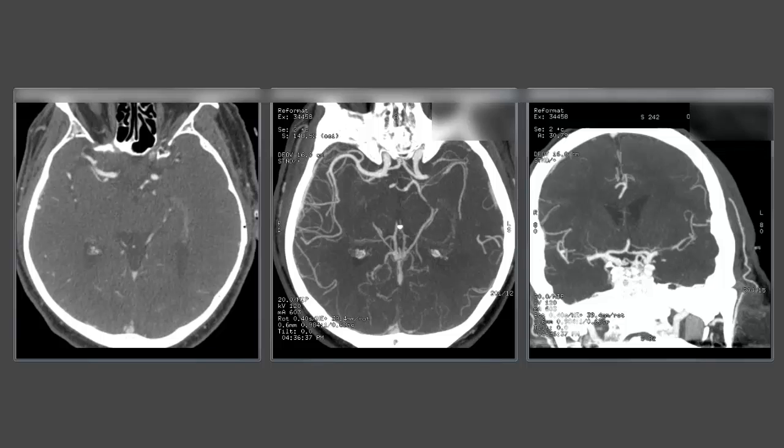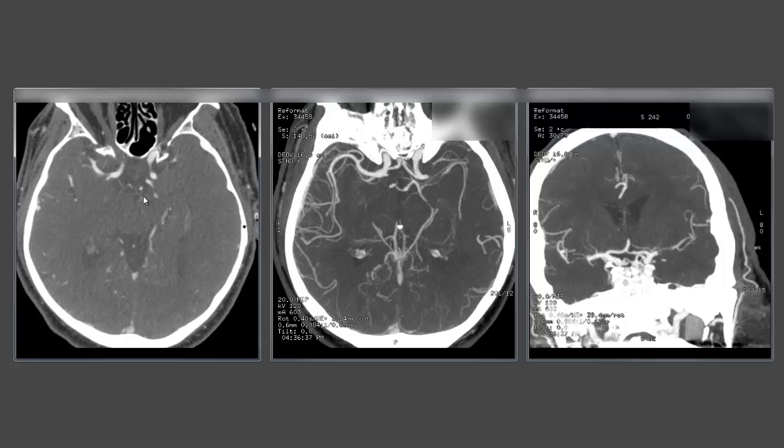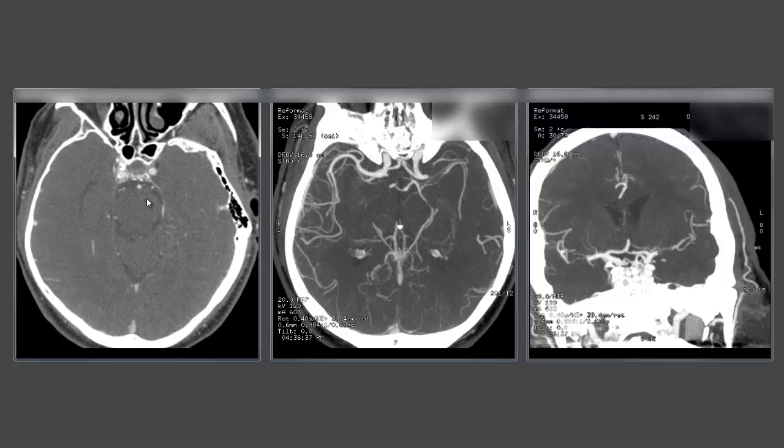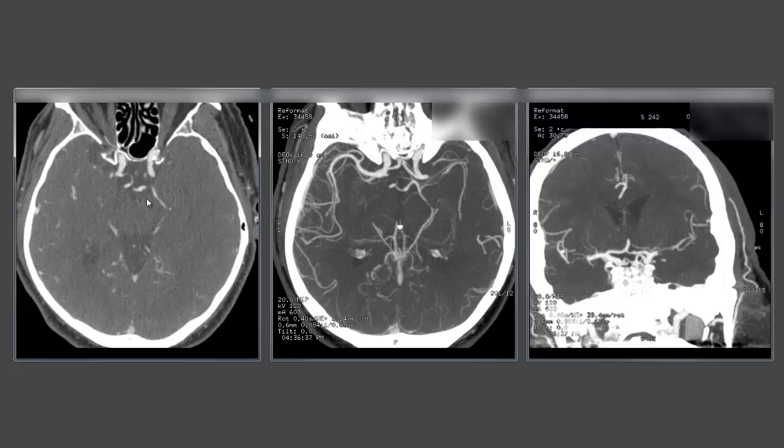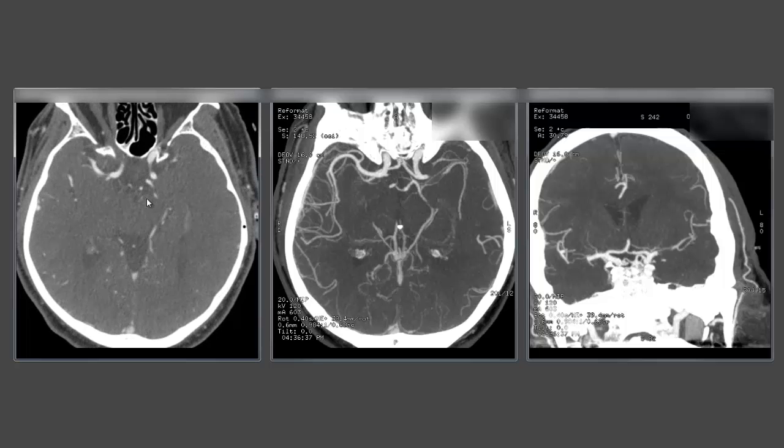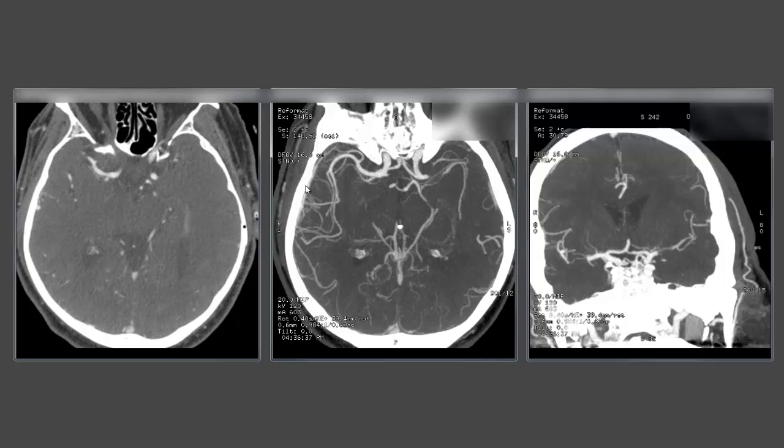A MIPS is a maximum intensity projection and it essentially consists of taking information from a set of source images, something very similar to these very fine cuts here. In this case 0.6 millimeter thick slices, putting together information across many of those slices into thicker wedges.